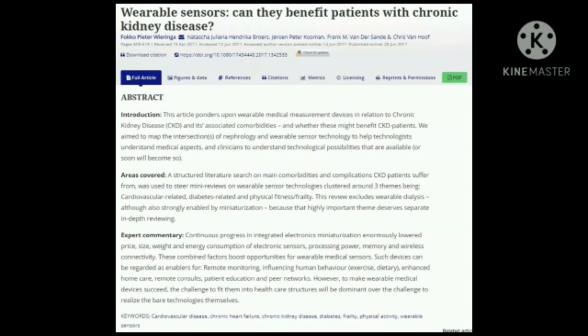The worldwide IEC standard for medical devices intended for use at home and in other daily life specifically states that wearable outdoor use is reasonably foreseeable and requires at least an IP22 protection level: protection against injury from fingers or similar sized objects. Also, vertically dripping water shall have no harmful effect when the enclosure is tilted at an angle up to 15 degrees from its normal position.